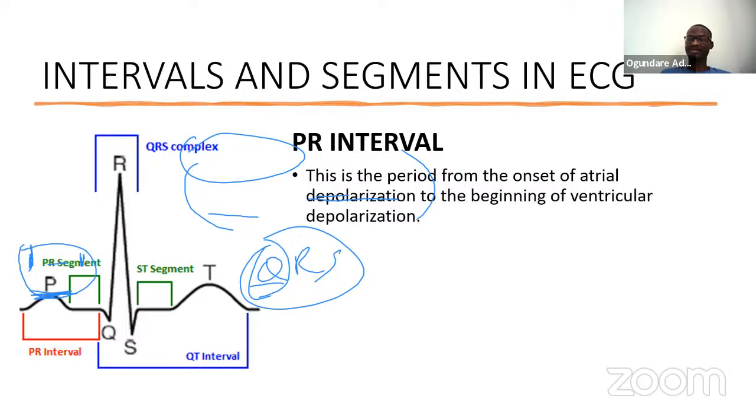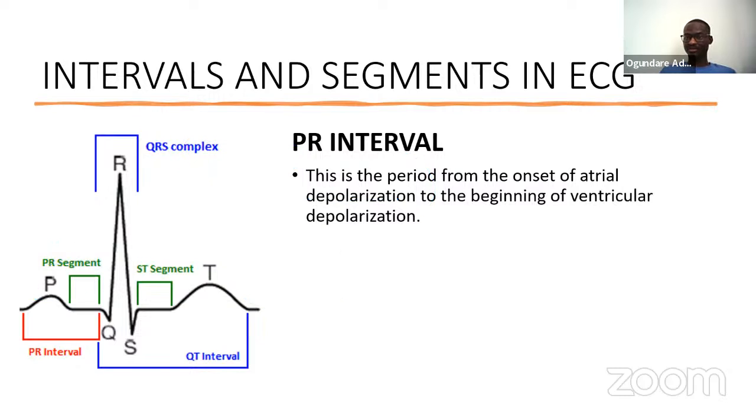It is very significant in interpreting ECG. So that is what the PR interval represents, and that is the significance of it.